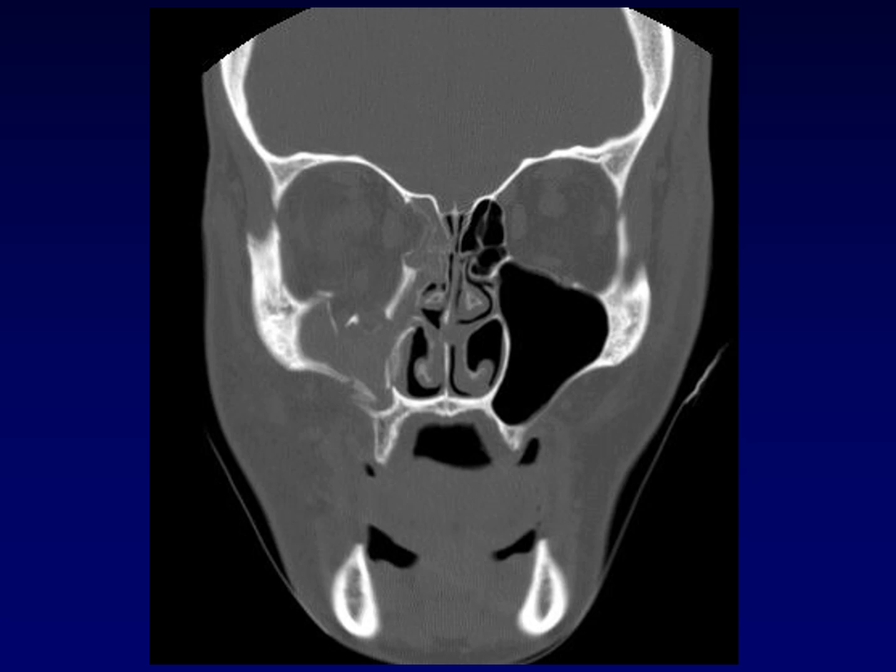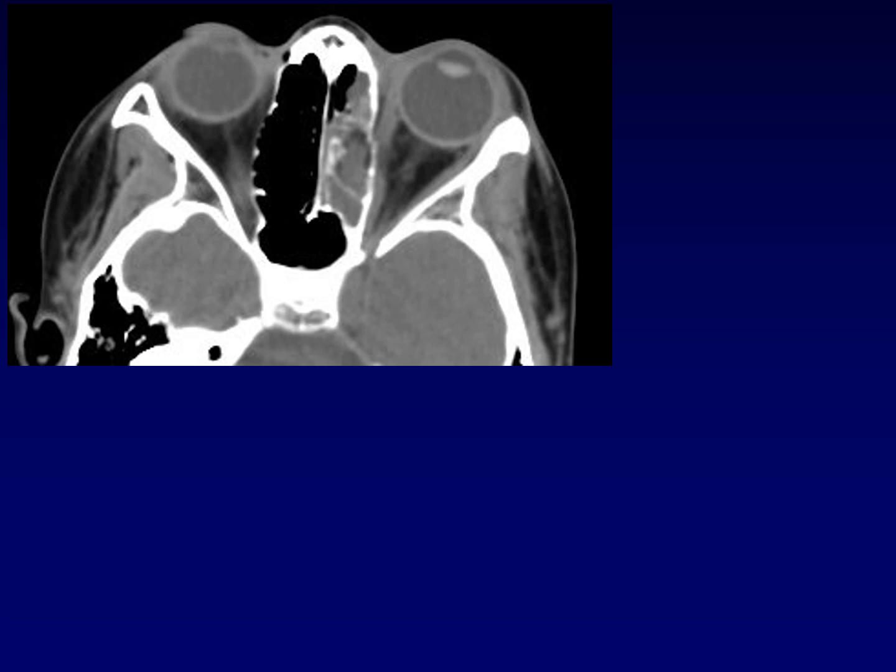Don't forget to look at the lamina papyracea — it's another common site, not as common as the floor, but another common site for blowout fractures with herniation. Be very careful looking for fat where it doesn't belong. In this example, there is blood within the ethmoid air cells, which is suggestive but not a strong indication of fracture. However, the presence of fat within the ethmoid air cells is a strong indicator of an underlying fracture, and you should look carefully for it.